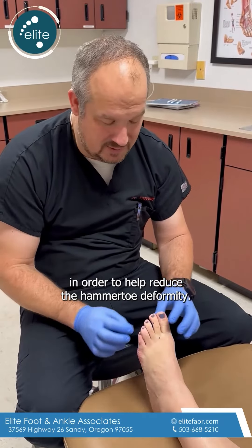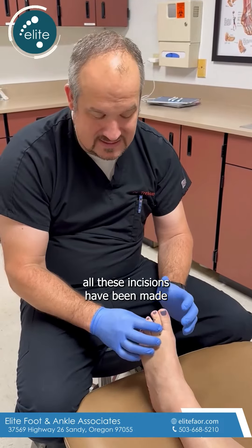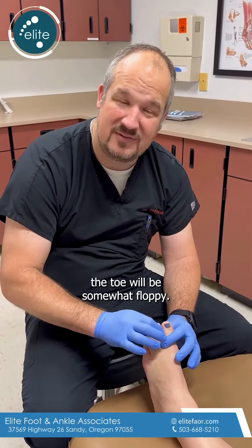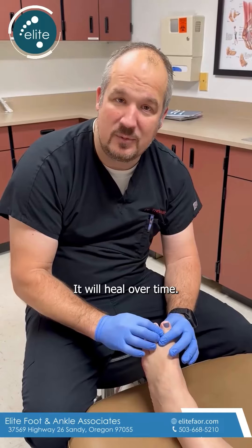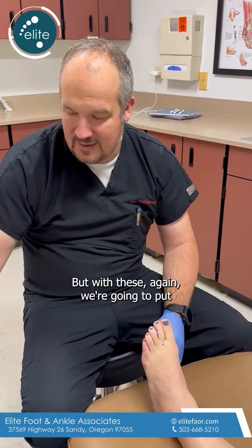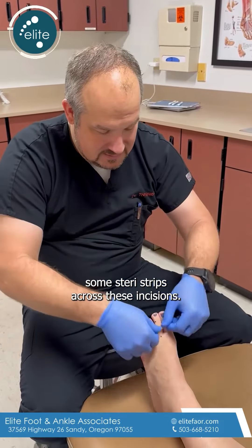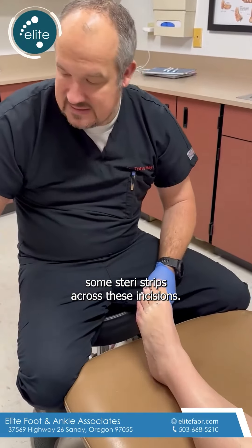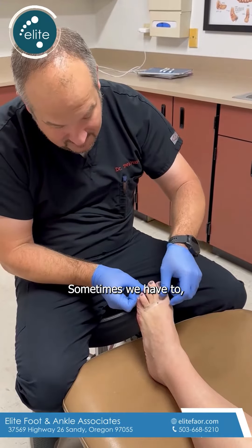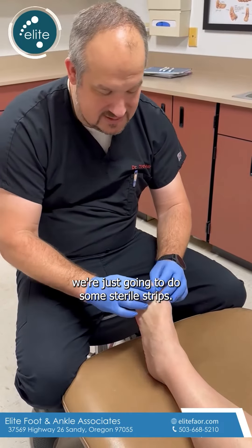Once all these incisions have been made and the soft tissue and bone have been released, the toe will be somewhat floppy — don't worry about that, it will heal over time. We're going to put some steri-strips across these incisions. We don't usually use sutures; sometimes we have to, but most of the time we're just going to do some steri-strips.